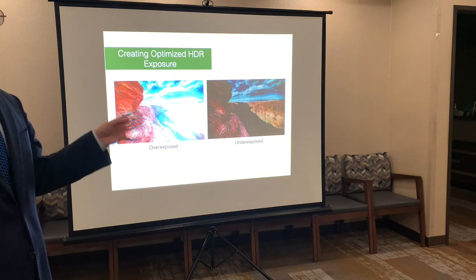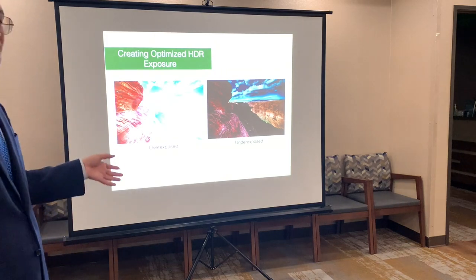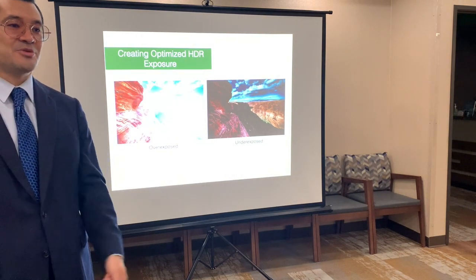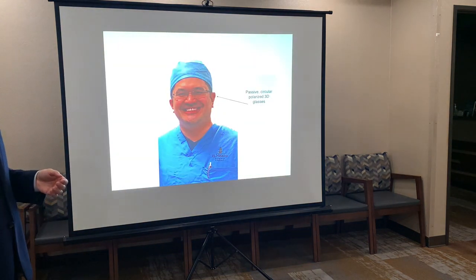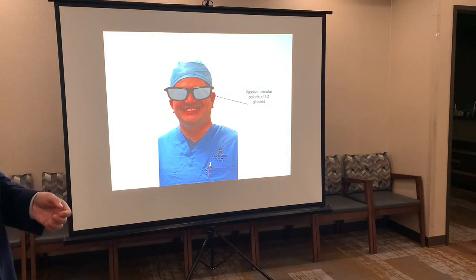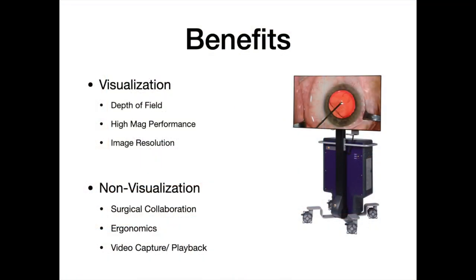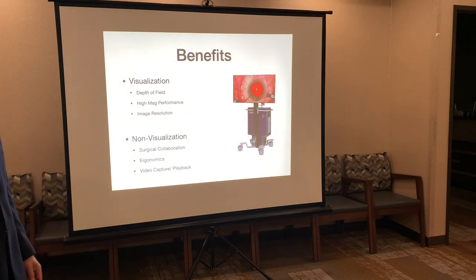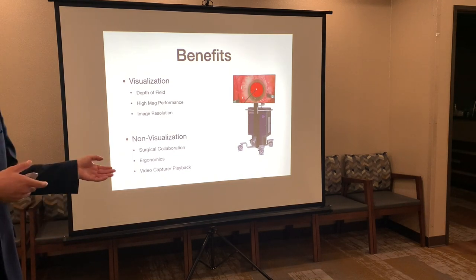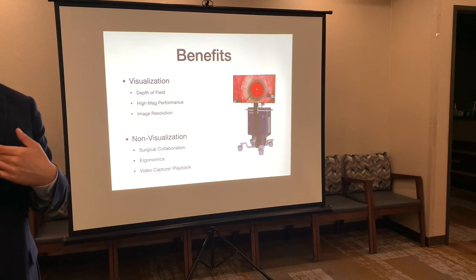Look at this. We can keep the lights really low during surgery so the patient doesn't have to stare at a super bright light. We can turn the light down, but then have the digital processor increase our exposure after the fact. Look at that. We can take an image. I just have to put these 3D goggles on, and now we can see it. So benefits, you can get maybe some image processing, maybe better visualization, ergonomics. I'm going to be a little bit happier, and collaboration, that means I can showcase a video to another surgeon and they will really be able to experience it as I did because it's 3D.